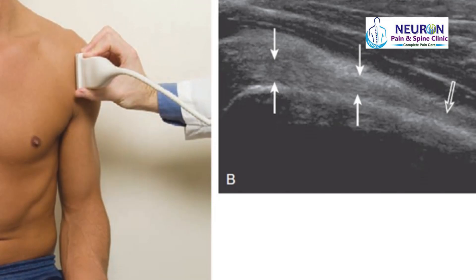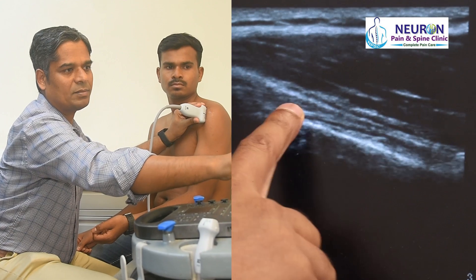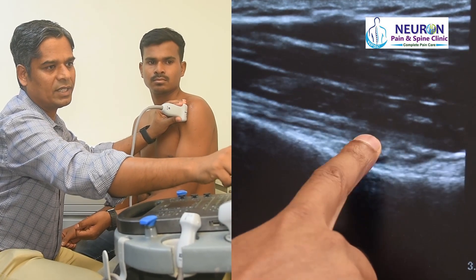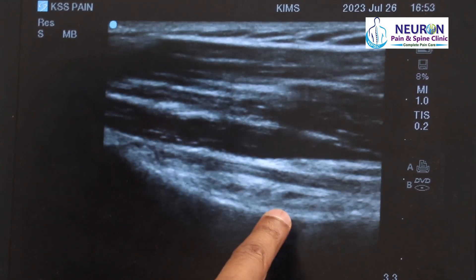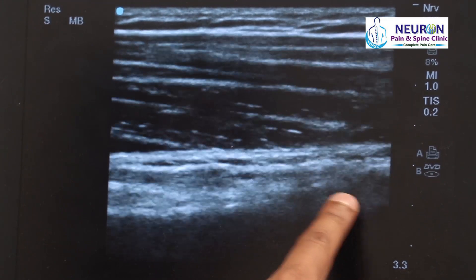In long axis, this is the humerus and that is the biceps tendon. One can see the fibrillar appearance of the biceps tendon. As I slowly come down, I look for any fluid, tenosynovitis, or biceps tendon pathology. That is a tendon, and there is a small blood vessel. As I slowly go down, the tendon will merge and slowly become the muscle.